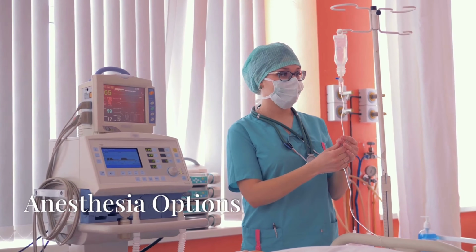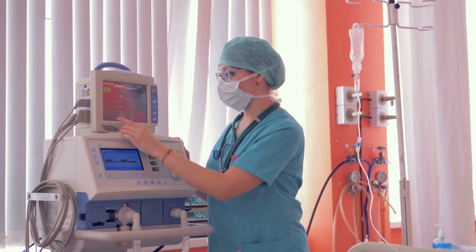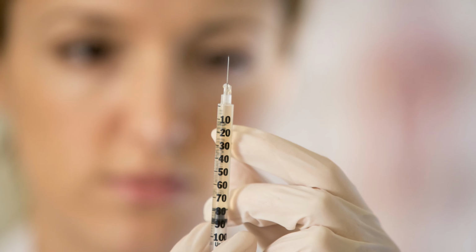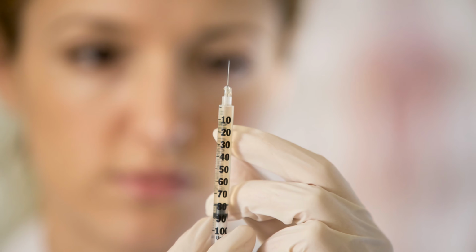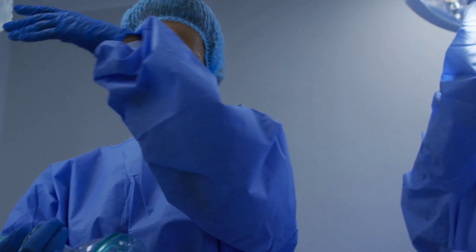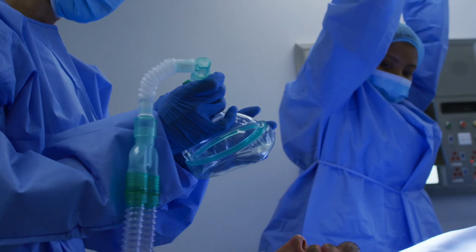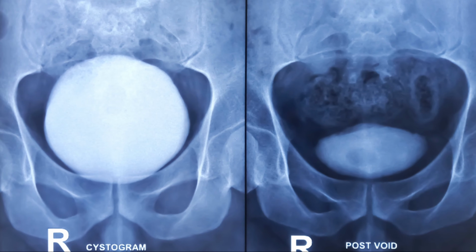Now, let's talk about the anesthesia options available for this procedure. Cystoscopy can be performed under local or general anesthesia. During a cystoscopy under local anesthesia, patients receive local anesthesia to numb the area around the urethra or the lower part of their body. Alternatively, general anesthesia, which puts them to sleep during the procedure, may be used. Each option has its benefits depending on the specifics of the case and the patient's comfort.